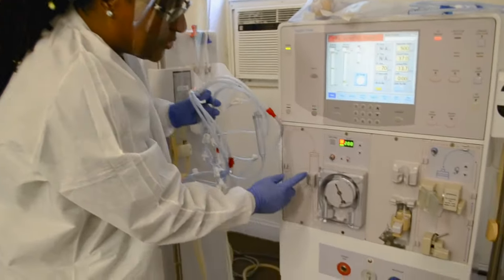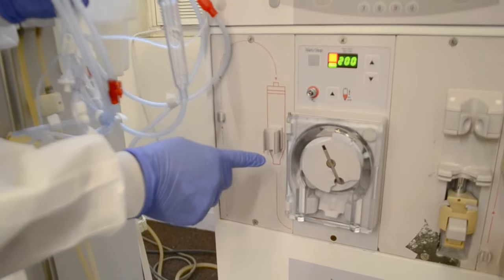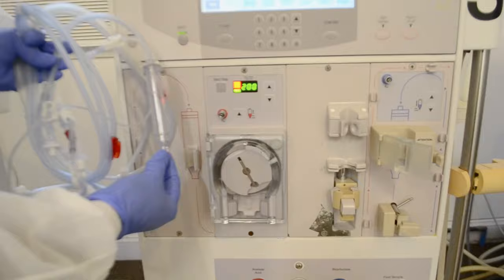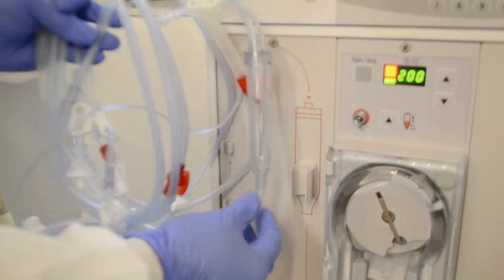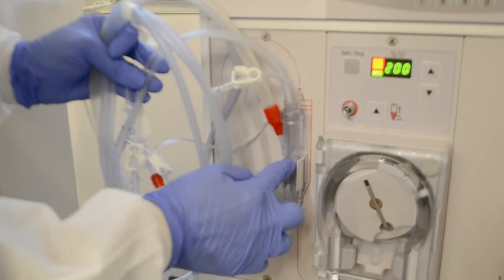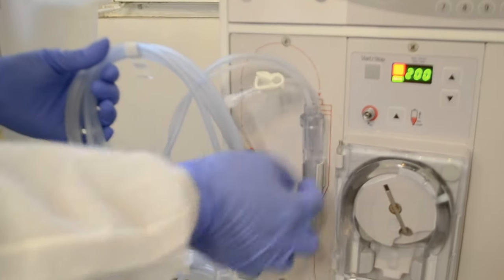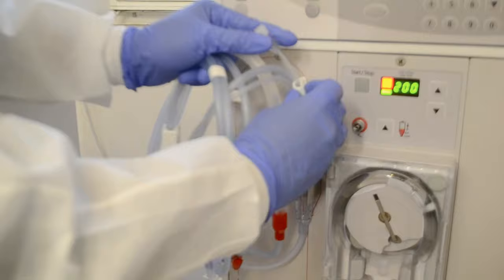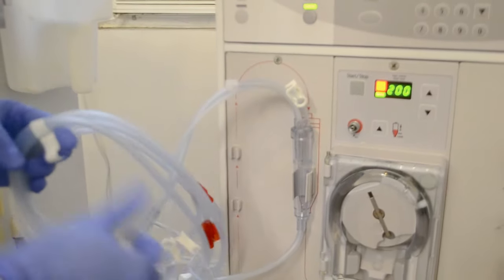If you look at your machine, you'll see that it's color-coded, so there is no confusion. Also, the shape of the chamber indicates the direction it's supposed to go. You're going to gently put this chamber, which is the arterial chamber, right in the slot. Remember, if you break any part of the machine, it has to be taken out of service. I'm going to clamp this line because I'm not going to use it.